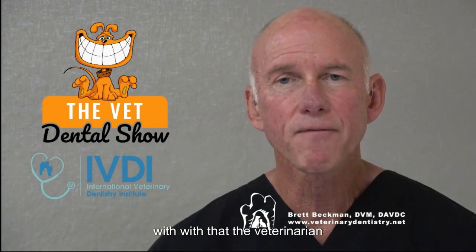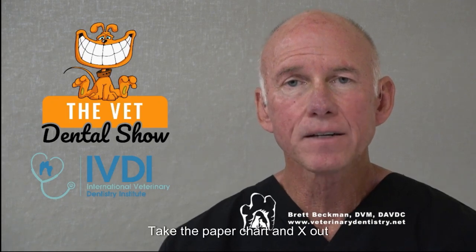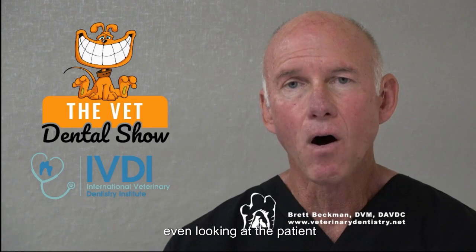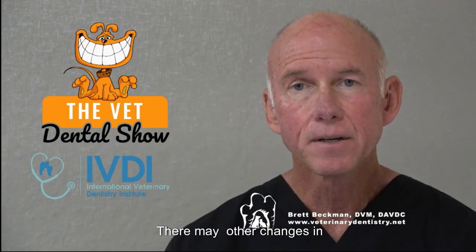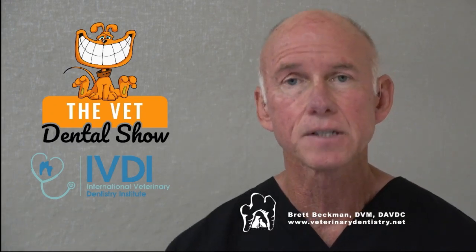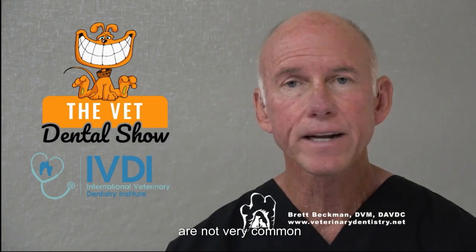But with that, the veterinarian who's competent at reading dental radiographs can look at those radiographs, take the paper chart, and X out all of the extractions that they know are going to happen without even looking at the patient. There may be some severe gum recession. There may be other changes in teeth that are not showing radiographic changes. So those can be quickly added to that chart with very little visualization. But I will say that those things are not very common.